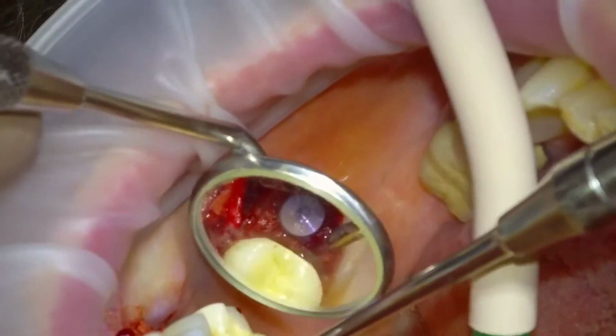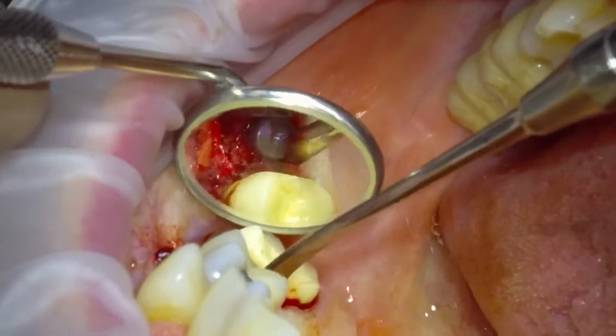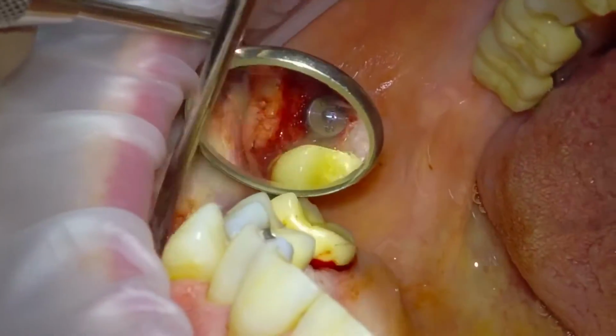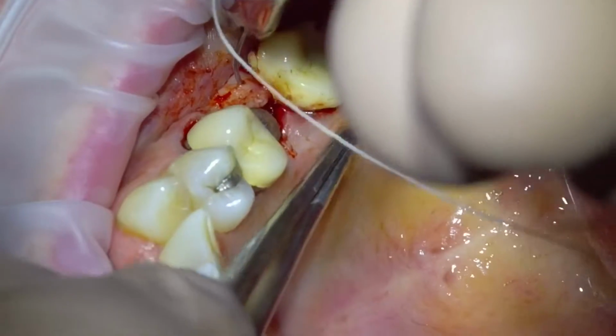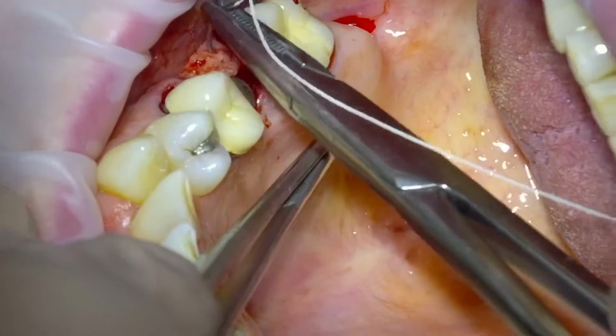And that's it, and that's our implant in place. Very straightforward. Excellent primary stability with the BLX implant. And then just a couple of very simple little sutures, just mesiodistally, just to tie it together.